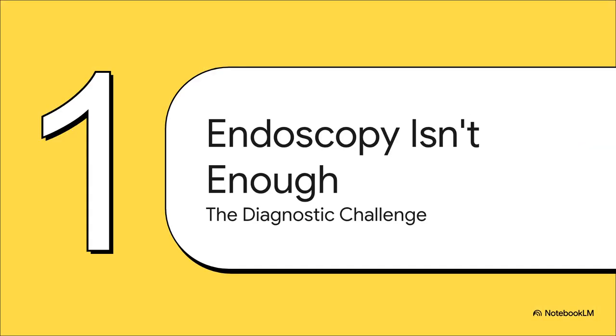All right, let's set the stage. You've got a patient with symptoms that just won't quit. You do the endoscopy, the initial workup looks totally normal, but the patient is still miserable. This is the exact moment, that clinical crossroads, where physiologic testing becomes absolutely essential.